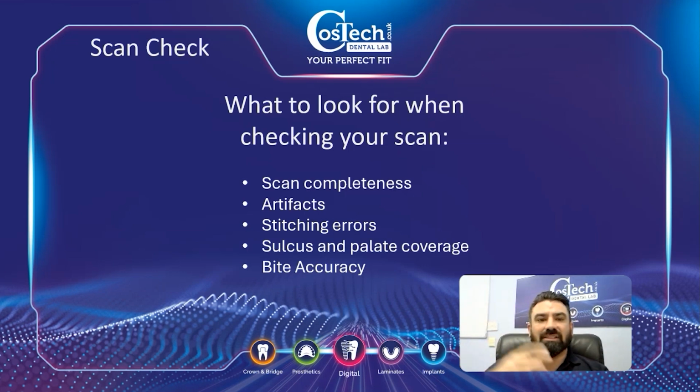You can just send that as a supplementary scan, and then in the lab, we can use that as our reference to make sure that the second one that you've done actually matches up. Failing that, we might print them out and hand occlude them and go the old technician way and say, right, let's just check if that's right. But what we found is if you review the scans and you don't see any open anterior bites, then you're absolutely fine.